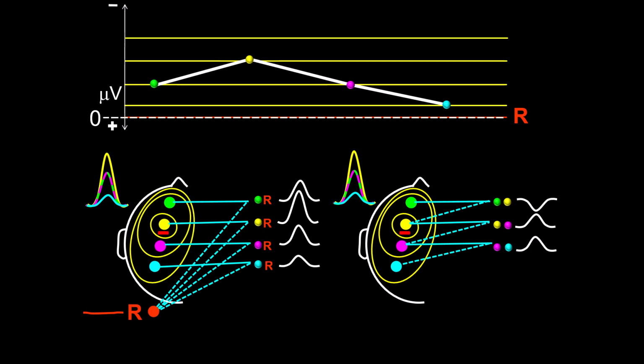Now I have introduced the same potential but using a common electrode reference montage to evaluate them. In this case, I have placed the reference at a neutral point. Notice that the wave from the fictitious neutral point has not changed when compared with the one previously shown. That is so because both are collected from the same fictitious neutral point. Also notice that the waves pointed by the arrow are the same as those recorded using a fictitious neutral reference.